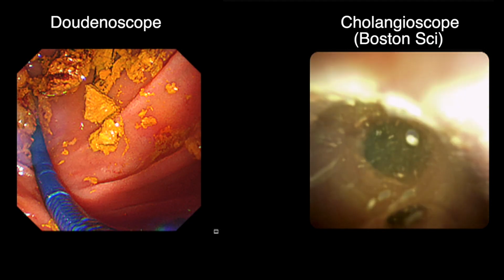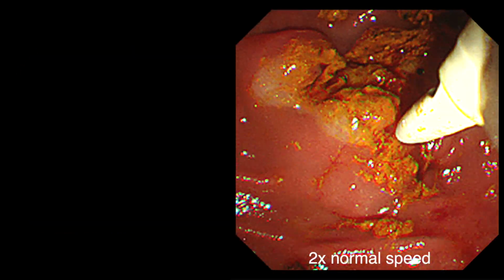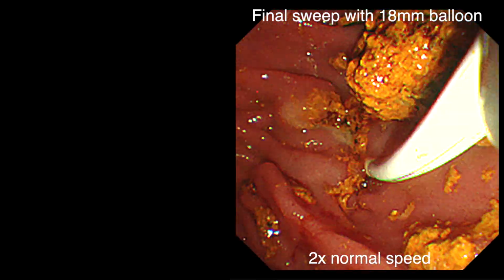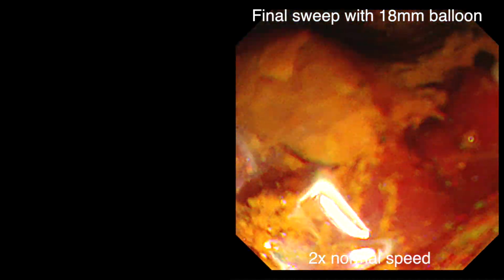Since the upper bile duct is about 20 mm in diameter, we now sweep the duct with a 15 to 18 mm balloon inflated to its maximum diameter. Using this large balloon, the last remaining fragments of stones are extracted.